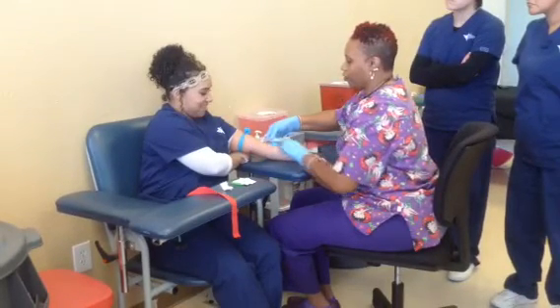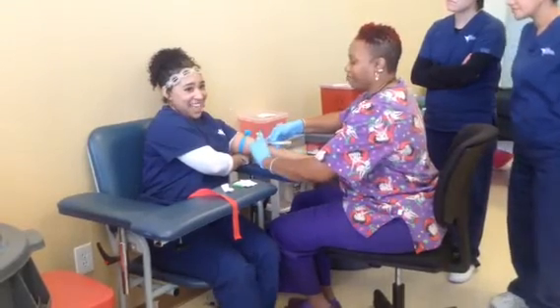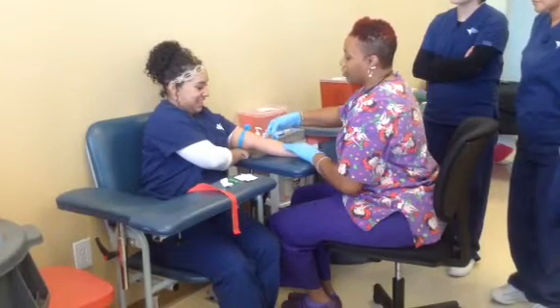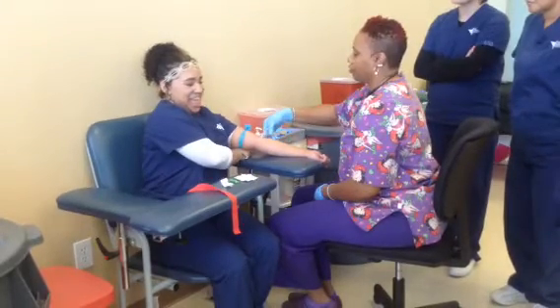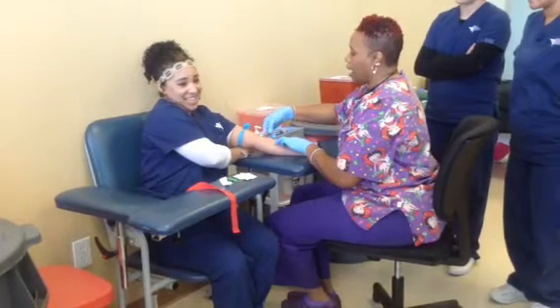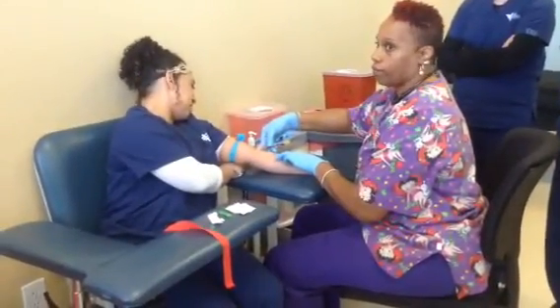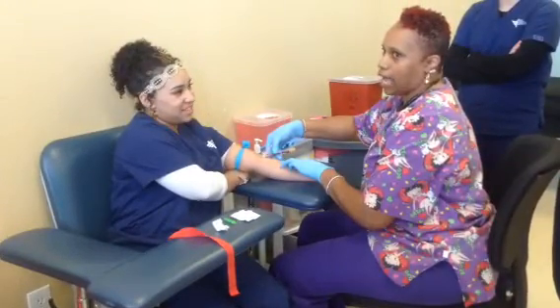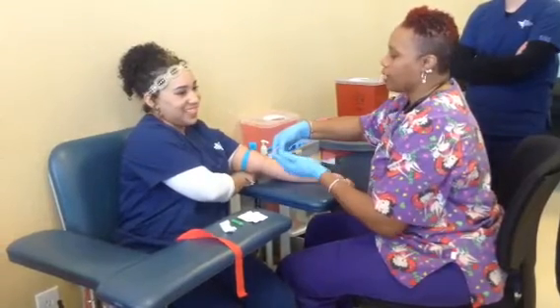No flow. It's there — I just have to catch it. What I just did was a redirect, and that's very common. You actually want to redirect the tube before automatically terminating the draw. A lot of patients say, oh, I don't want anybody fishing in my vein. Well, we're not fishing — it's actually a redirect.